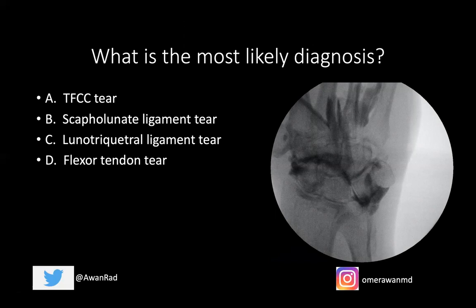If you take a look here, the key to all arthrogram cases is understanding where contrast should be and where contrast has gone in an area where it shouldn't be. Right off the bat, we notice there's some contrast outlining some of these tendons here. This is iatrogenic. When you do a dorsal injection, you're going to outline a lot of the extensor tendons, and I want you to avoid that — this is very common when doing wrist arthrograms.